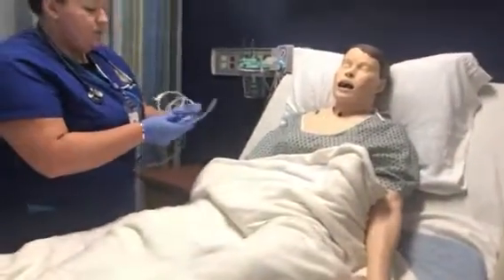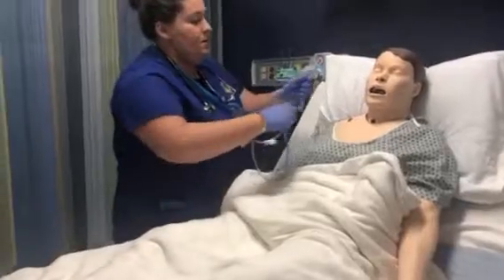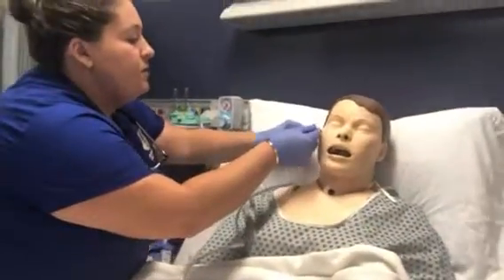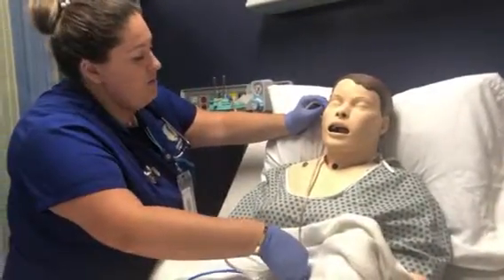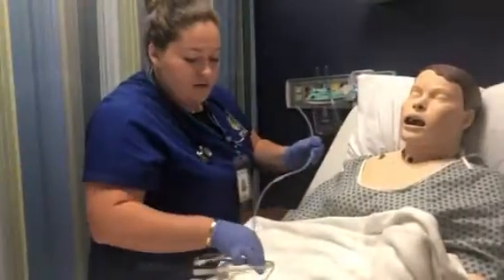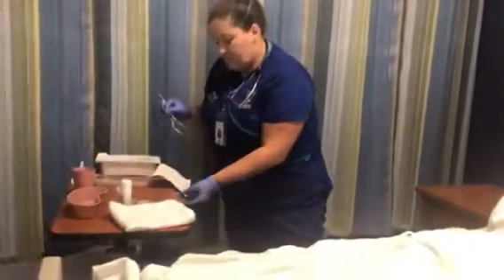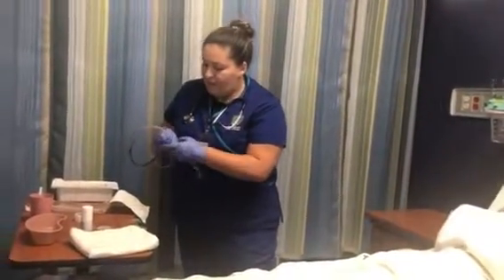I'm going to measure from the tip of the nose to the ear to the xiphoid process, which is at the bottom of the sternum. I'm going to place a piece of tape there to mark to where I need to go.